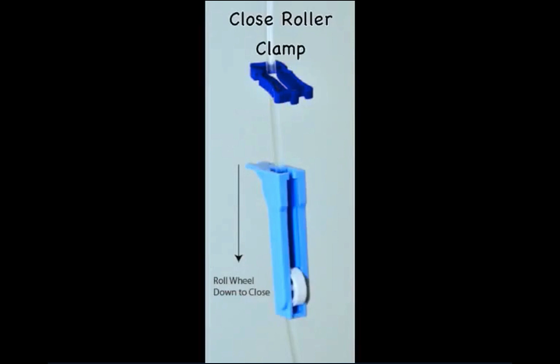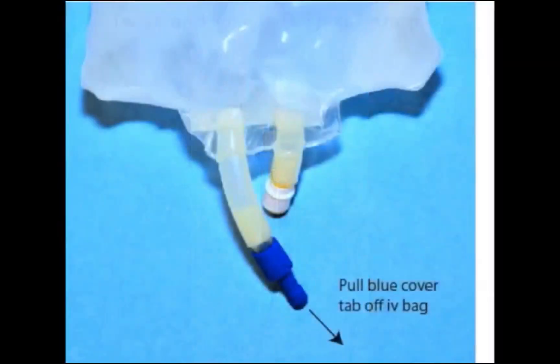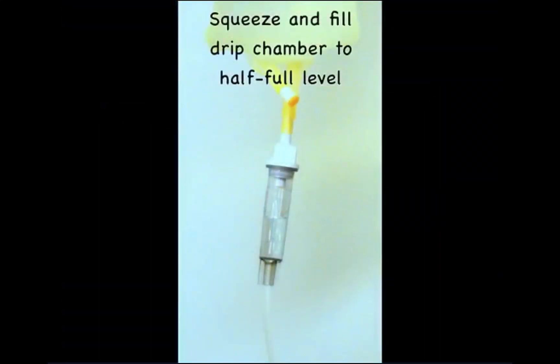Remove the intravenous tubing from its package and close the roller clamp. Remove the cap on the IV tubing spike. Remove the cap on the IV access port of the intravenous solution. Insert the tubing spike into the access port with a twisting motion.